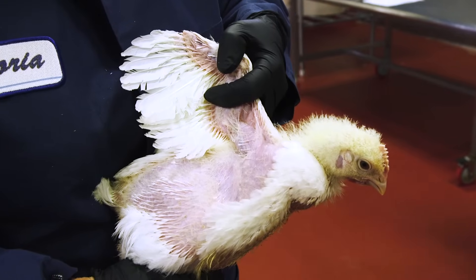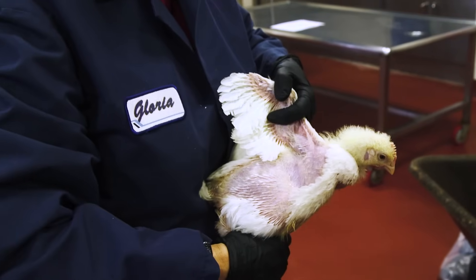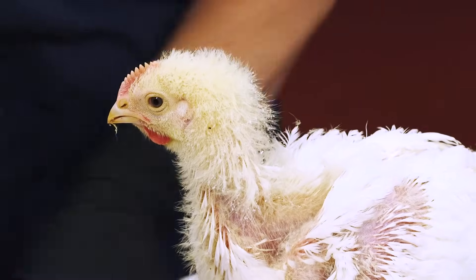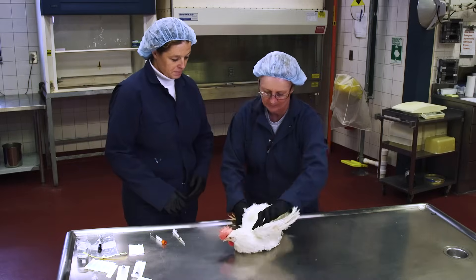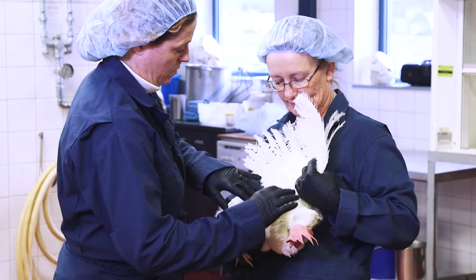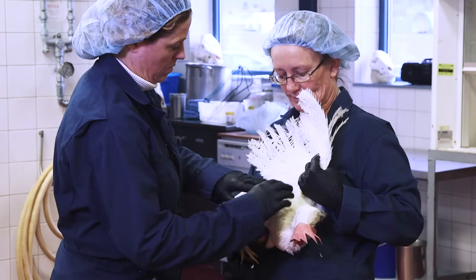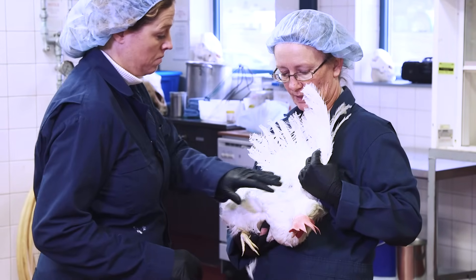Next, let's look at handling. It's important to handle your bird safely to avoid injuring the bird and to get a good quality blood sample. The method of holding the bird may vary based on the age or size of the bird, and whether one or two people are involved in the process. If an assistant is available, collecting blood with two people may be easier. One person can concentrate on bird restraint and hematoma prevention, while the other person collects and handles the blood sample.